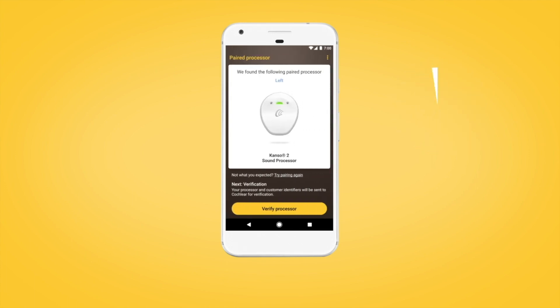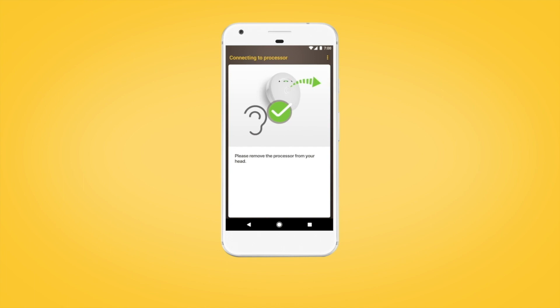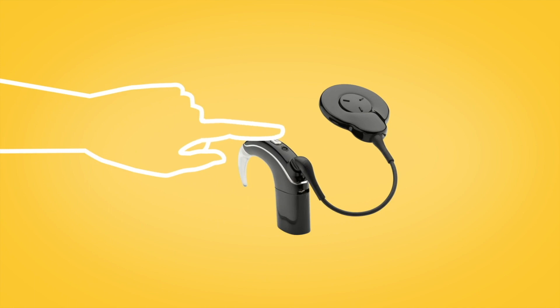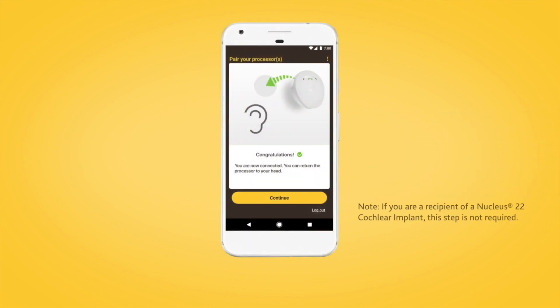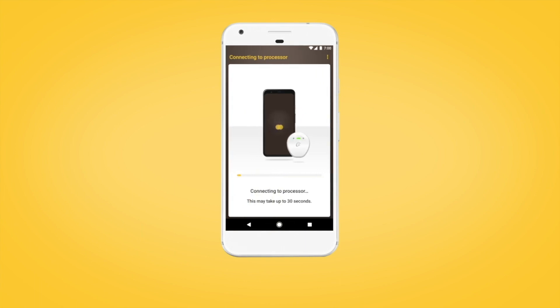The next step is to verify your sound processor. Tap Continue, then remove your sound processor from your head. Briefly press the button on your Nucleus 7 sound processor, or if you have a CANZO 2 sound processor, tap it twice. Then return your sound processor to your head when prompted. Tap Continue to complete pairing. This may take up to 30 seconds.